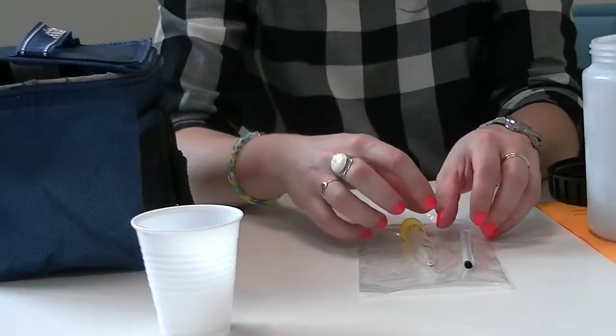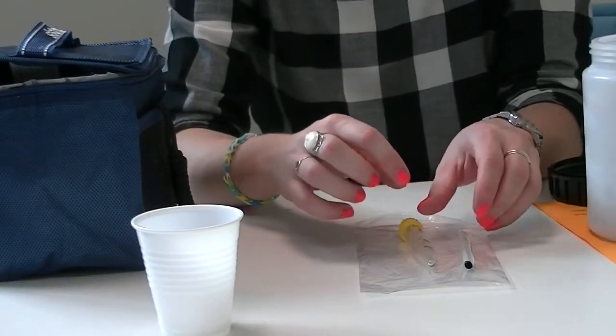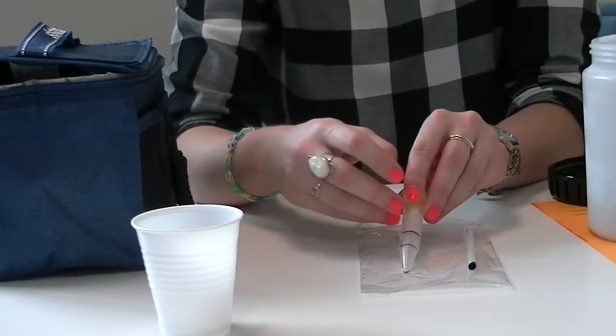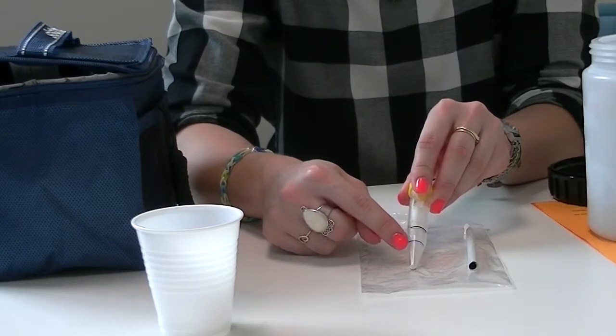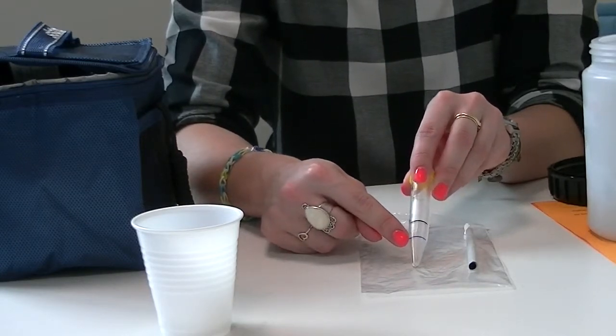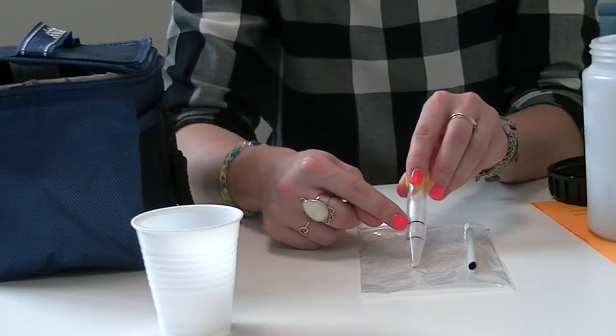Inside the bottle you'll have a Ziploc bag, and inside the Ziploc bag you'll find a straw and a saliva vial. The vial has two lines: a blue line and a black line. You'll be aiming to get above the blue line, but if you get up to the black line it'll be even better.